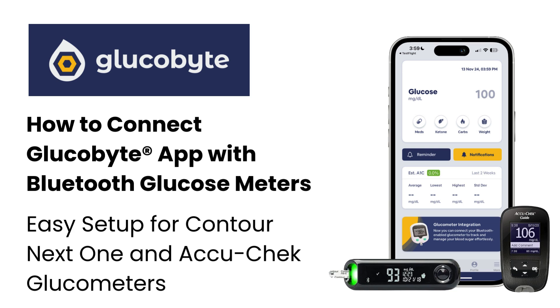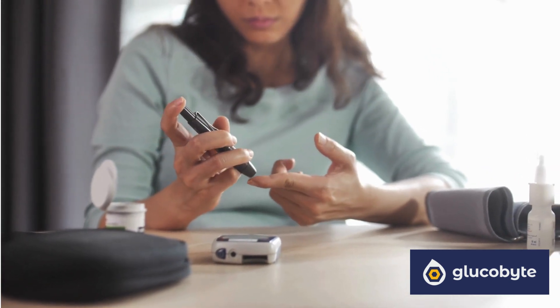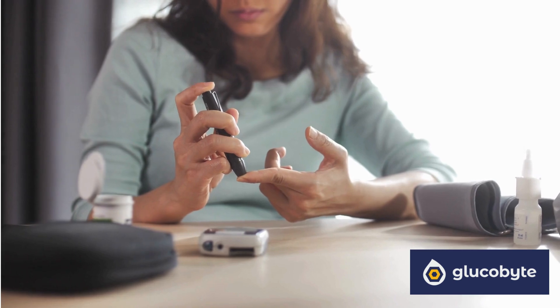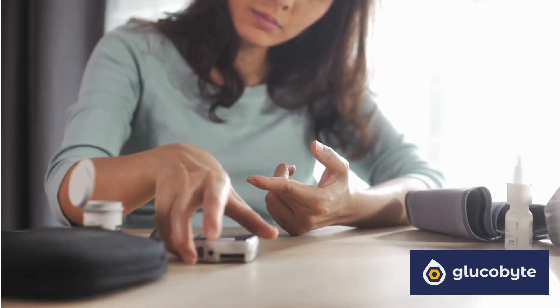Welcome to Glucobyte. Today we'll show you how easy it is to connect your Glucobyte app with Bluetooth-enabled glucose meters, specifically the Contour Next One and AccuCheck. Bluetooth connectivity provides the convenience of automatic data transfer, making it easy to monitor your glucose levels over time without manual entry. Let's get started.